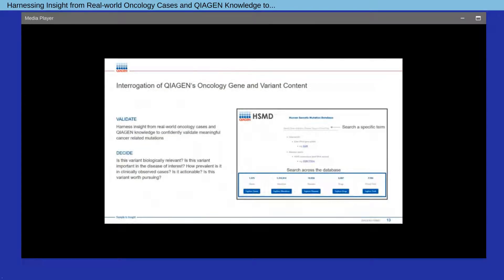How can you access HSMD? In its first version, the Kaigen oncology dataset can be accessed via a searchable interface. The interface allows for flexible searches by a specific term such as a variant, gene, drug, or disease, or searches across the dataset.